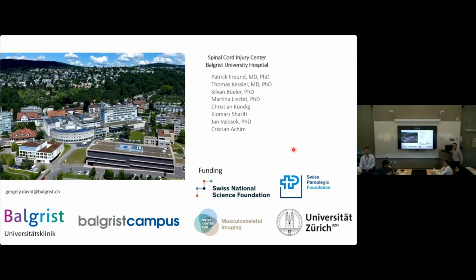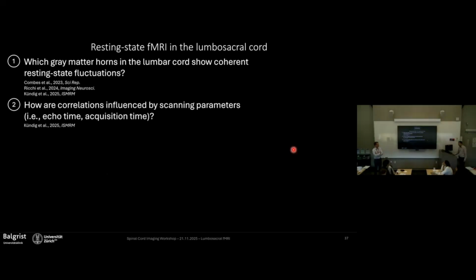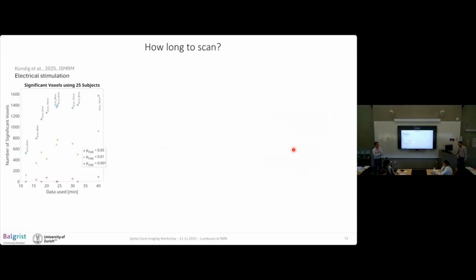I was curious about the question of how many runs or how much data you need. It seems to be 25 minutes, and I was just coming back to what Alexandra Timmerman was describing, that she found that having a longer run is actually better. If I remember correctly, you had 2 times 10 minutes, and this was less good. So I was wondering if you tried to address that hypothesis, number of runs versus length of runs. The 2 times 10 is not as good as, I mean, obviously there's a bit of noise in the process, but not as good as the longer run.